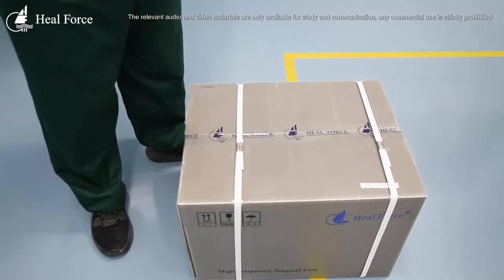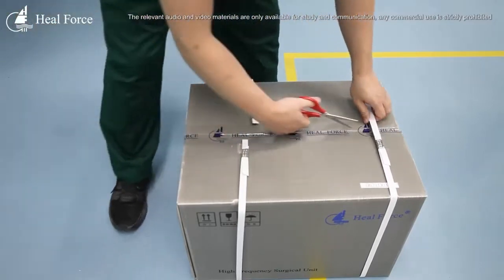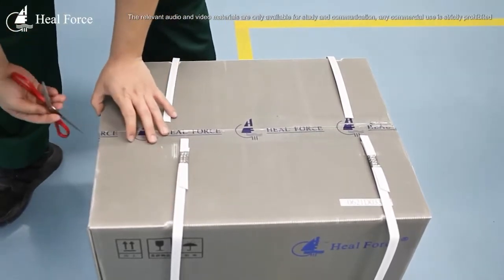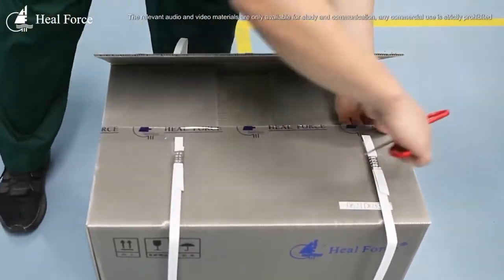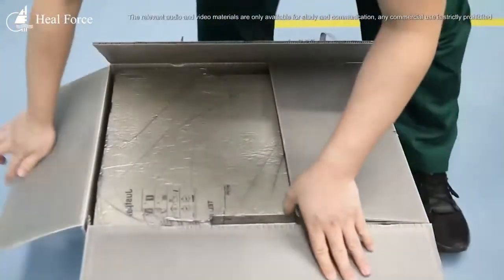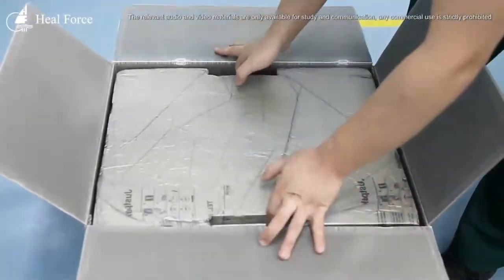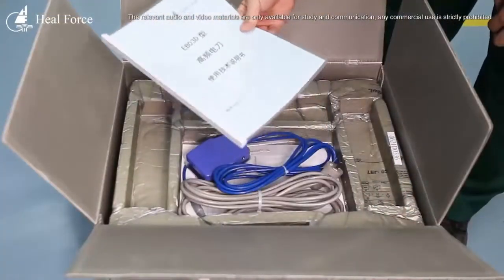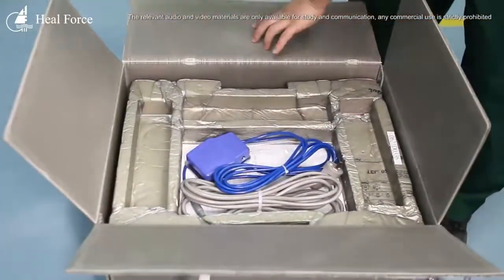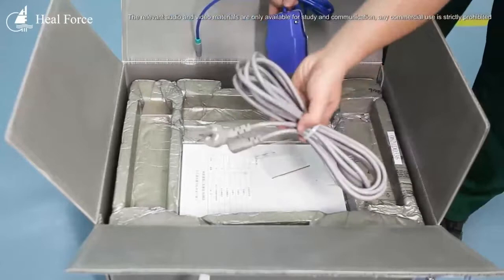Now I'm opening this equipment and let's see what's included. We can see a brief introduction of our equipment. Here are some accessories — this one is a foot control and this is the power cord.